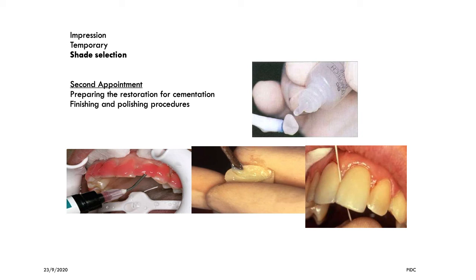Once it is ready, isolate the tooth and do selective etching of the enamel to prevent post-operative sensitivity after the restoration. So make sure the selective etching is done over the enamel surface. Once the selective etching is done for 15 seconds, remove the etchant and dry the tooth surface. Then after that, isolate it and apply the luting agent, that should be the resin cement.